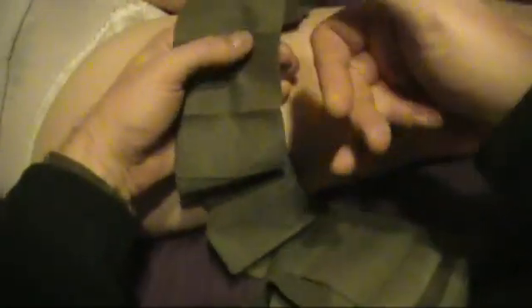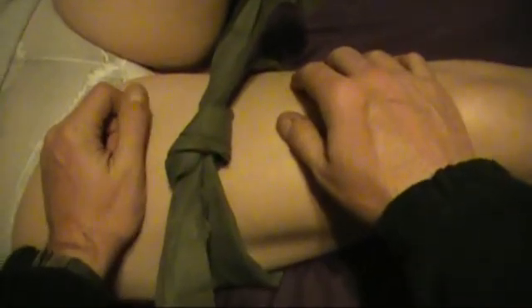Now, if I unfolded it completely, it would be triangular shape. And they make really nice bandanas, and that's what most of your Marines will steal them from you to make into. Okay, so, this is now my tourniquet. Same thing. Kneeling on the bleeding spot, holding it in place. Take my improvised tourniquet. Now, I'm going to tie a square knot, okay? Left over right. Right over left. Don't worry about this. If you can't tie knots, tie lots, okay?